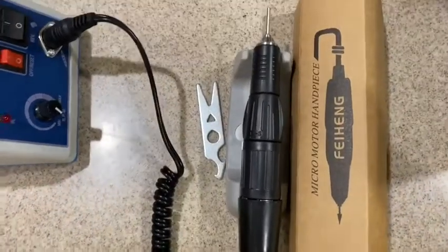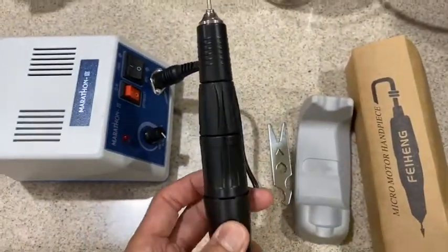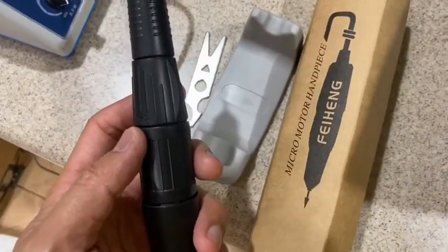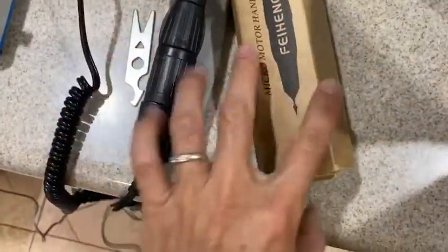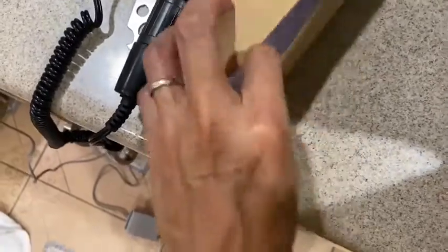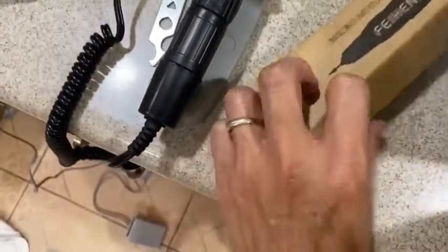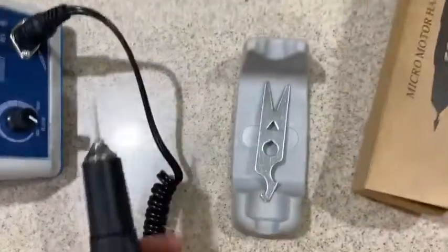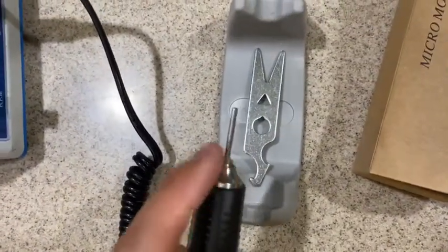Sometimes you might struggle at the beginning when you receive it. The assembly is easy, but the problem I had — and I'm not sure if all of you had the same problem — is this handpiece tool here, called the micro motor handpiece. It gives no instruction in the box, completely zero, on how to take it out or how to change the bur. They just draw you this little key thing which makes it even more confusing.